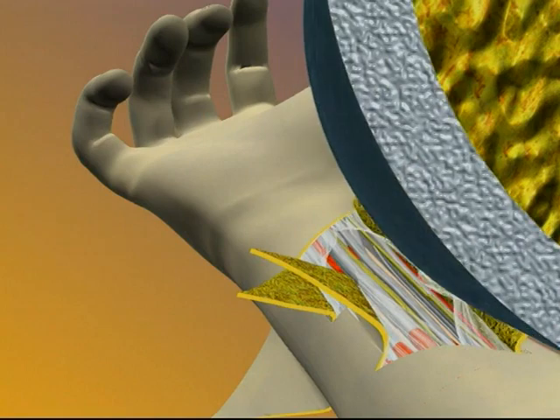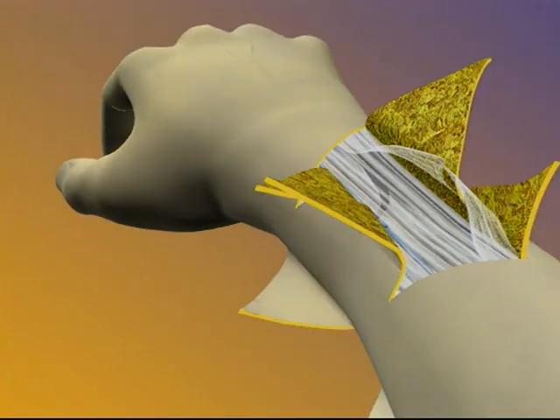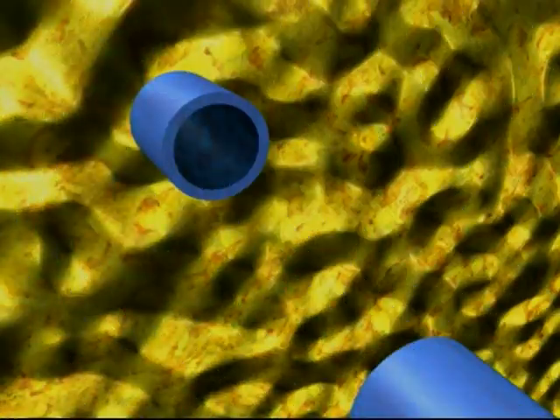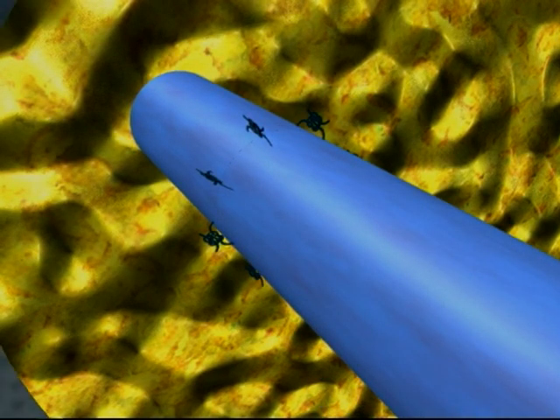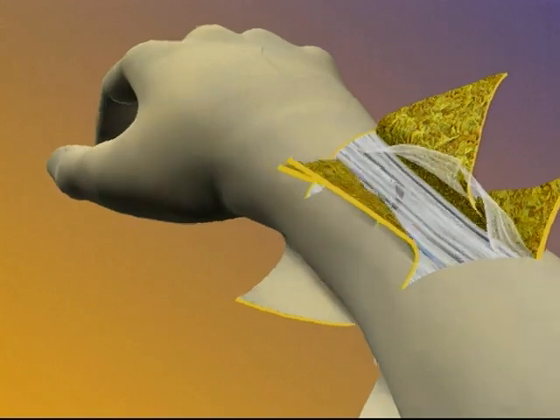Once these steps have been completed, the hand is turned 180 degrees and the veins are connected. Once the veins are connected, the use of the microscope is no longer necessary.